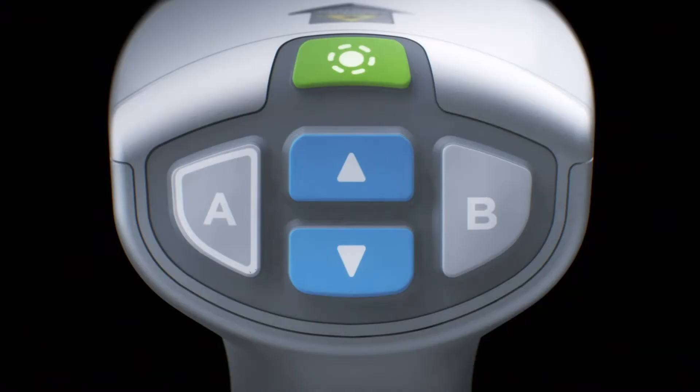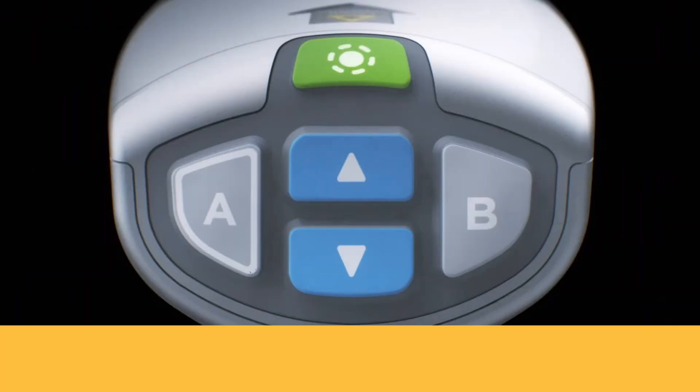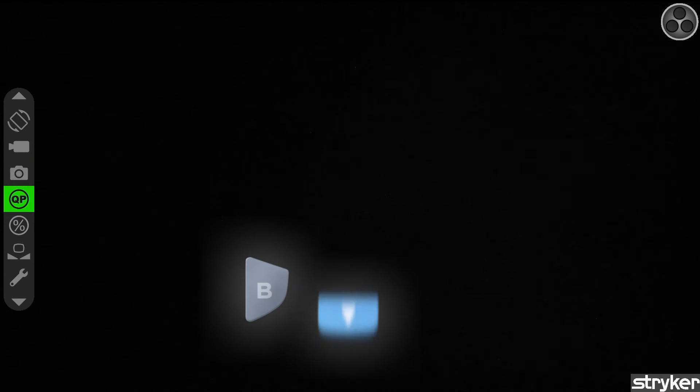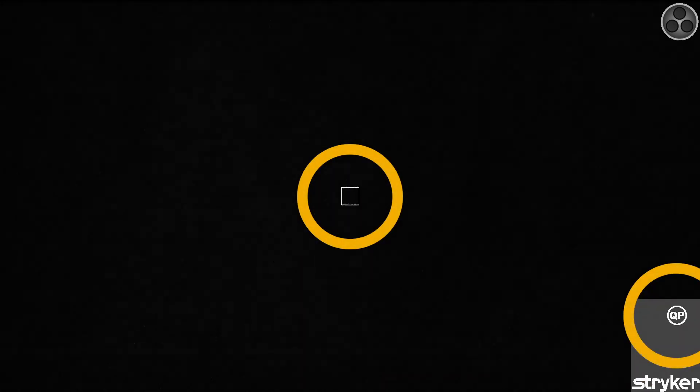To activate SpyQP, press the B button on the SpyFi to bring up the on-screen menu. Press the down button to highlight the QP icon and press B again to select. In other words, using the SpyFi handheld, press B, down, and B. You will know that you have successfully started SpyQP if there is a quantification box that appears in the middle of the screen and a QP icon that appears in the bottom right corner of the screen.